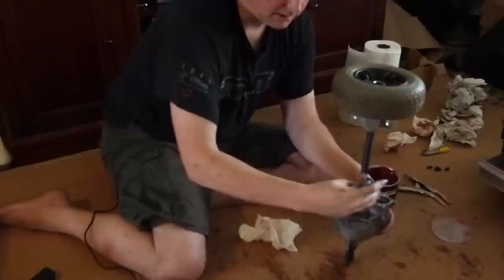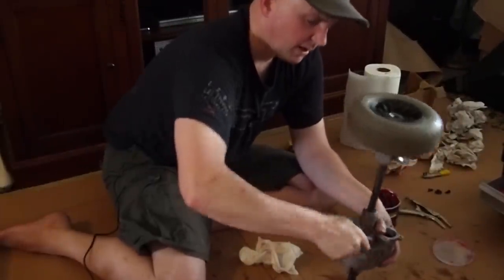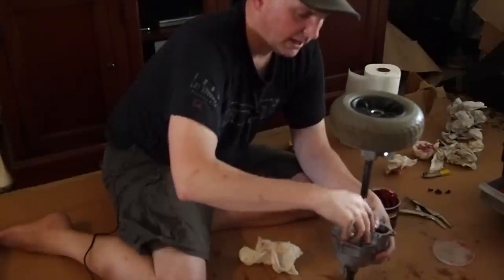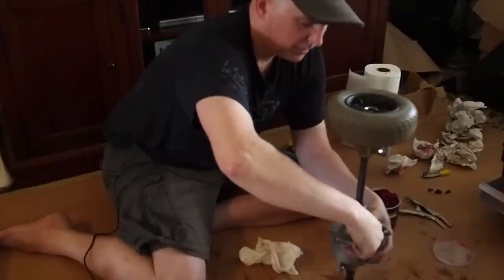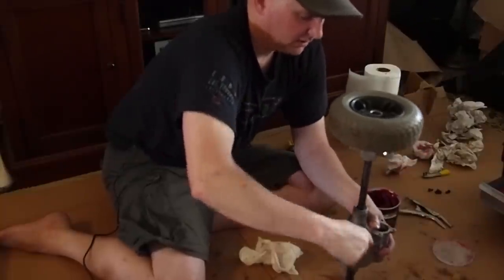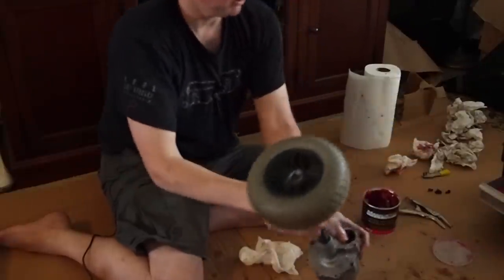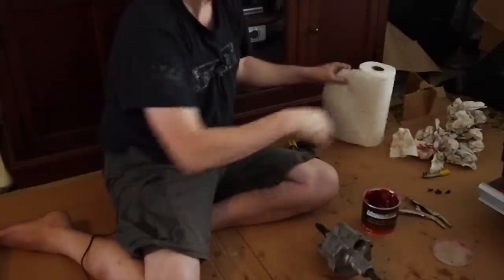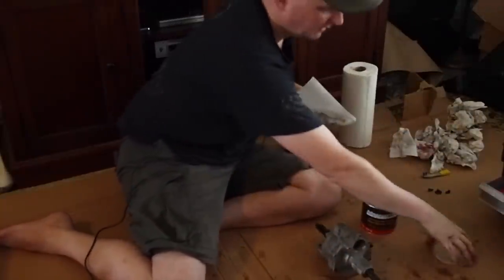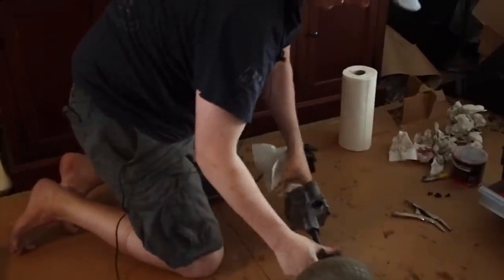Last time I heard that noise when I tested it, when I built this last time, but I thought, oh, it's fine. And the truth is it wasn't. That noise under power just magnifies. So there really shouldn't be any noise other than a little bit of mechanical gear noise because they are gears, but it shouldn't sound like anything's really wrong.